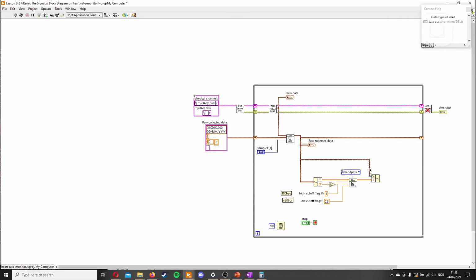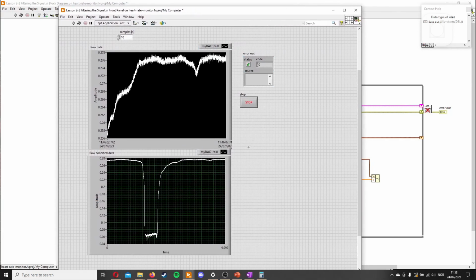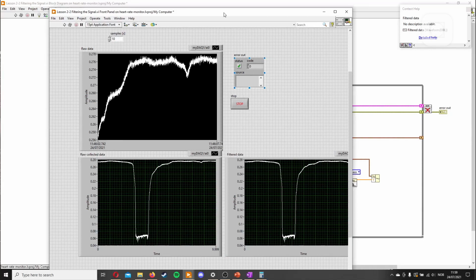And create a new one. We'll just copy this one. So let's make this one a little bit bigger. Put it there. And then just write filtered data. Okay.